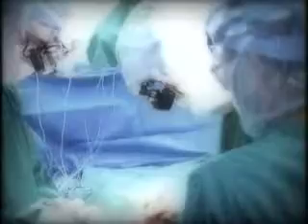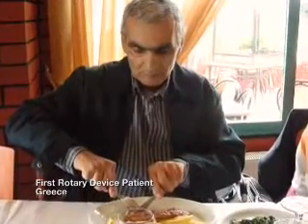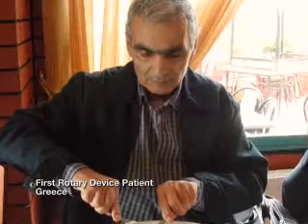We have started implants with the rotary VAD in Europe, and the results so far in a very limited number of patients have been spectacular. After about 3 months of support, the patient's own heart has recovered, our device has been allowed to be taken out, and now the patients are leading normal lives at home.